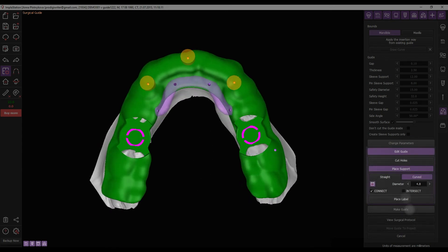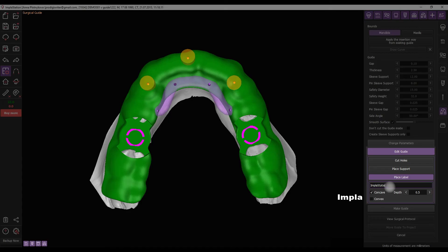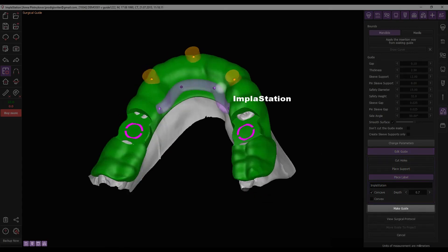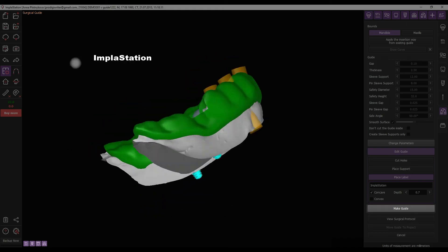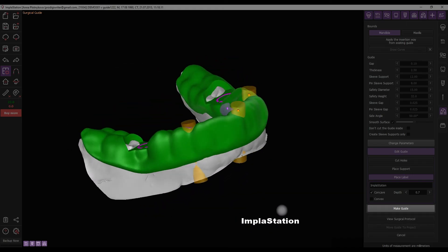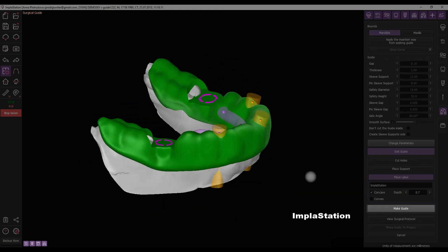To add labels, click the Place Label button. Enter the desired text and adjust its depth. Left-click on the surgical guide surface to place the label. Modify the imprint style by selecting either Concave or Convex checkbox.